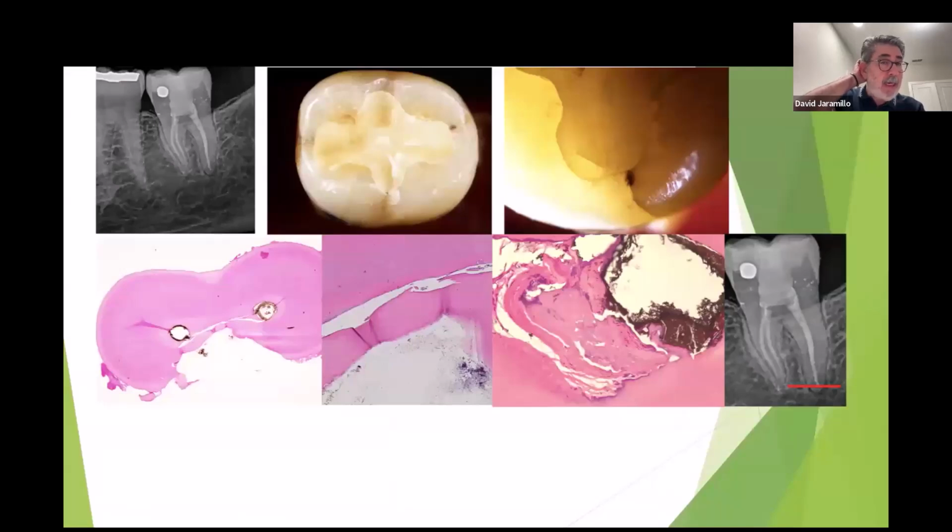Here is another case of a cracked tooth. The reason why it failed was because of the crack, but the endodontist asked the patient if she wanted to give it a try. They didn't charge for the root canal. He did the GentleWave treatment on this tooth. It was vital. You see the crack here. And we can see with the transillumination the presence of the crack, and the root canals are clean.